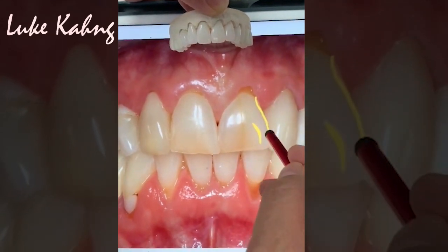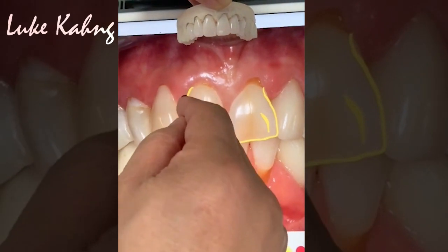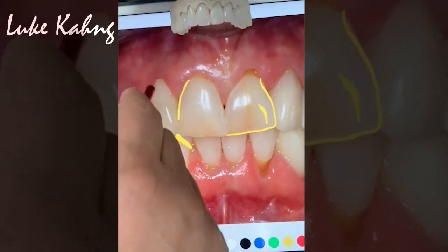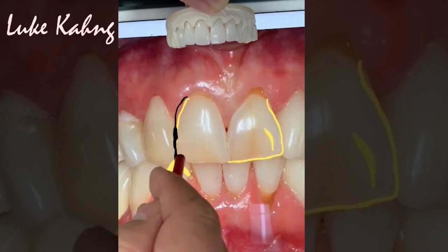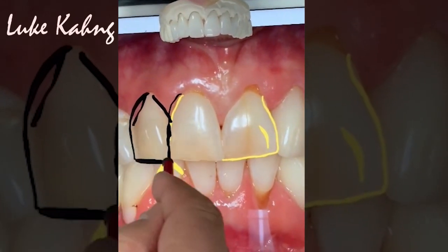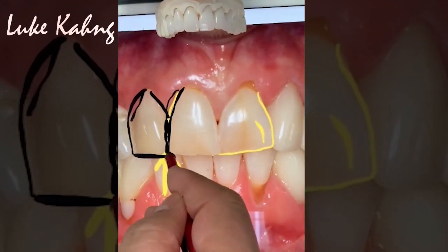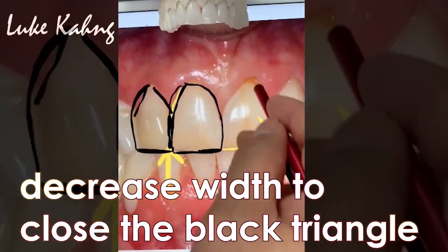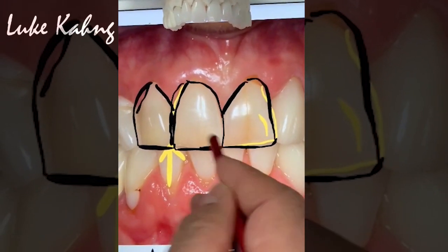So now let's get the shape, which is overlapping here. Okay, here's overlapping too. So that one, I have to make more bigger, wider, lateral. Okay, and then I have to decrease the width of the central, trying to close the black triangle. Okay, so that's our goal. It's a little bit feminine looking.